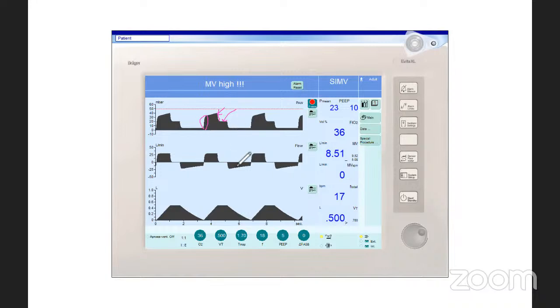At the same time, if you take a look on the expiratory flow, you can see that the peak expiratory flow is only at 20 to 25 liters per minute, so it is limited. You can see that the slope is kind of shallow and it's taking longer time to exhale because the time constant is increased.